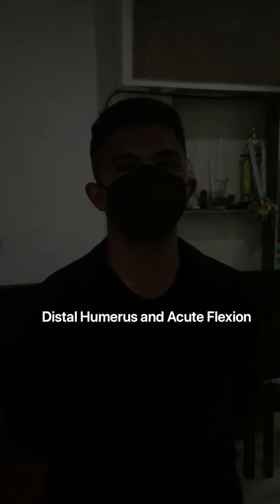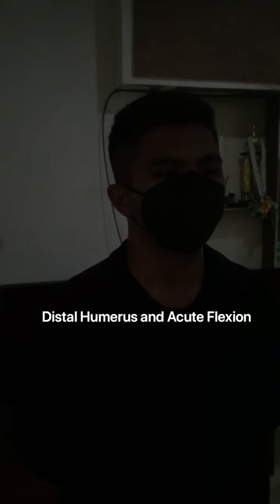Distal humerus in acute flexion. This is a modified projection for patients who are unable to straighten their arm due to pain. It's often conducted in the context of suspected supracondylar fractures in younger patients. However, it can be utilized in acute elbow imaging following trauma.